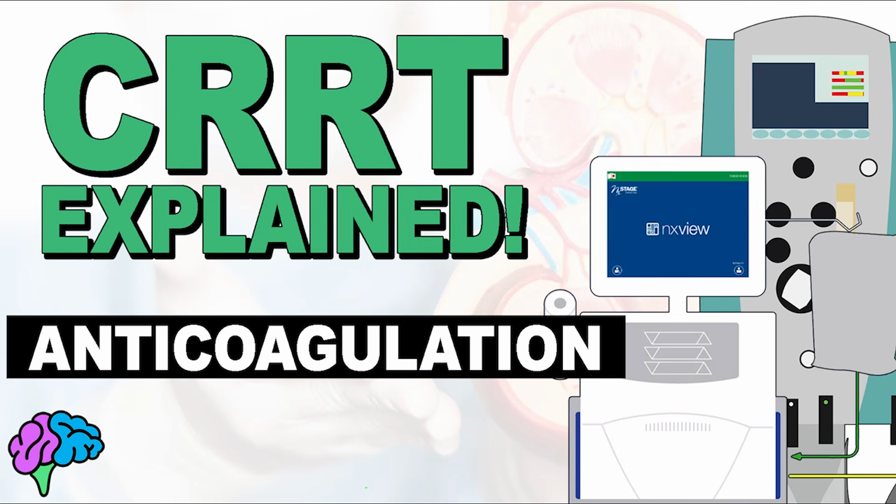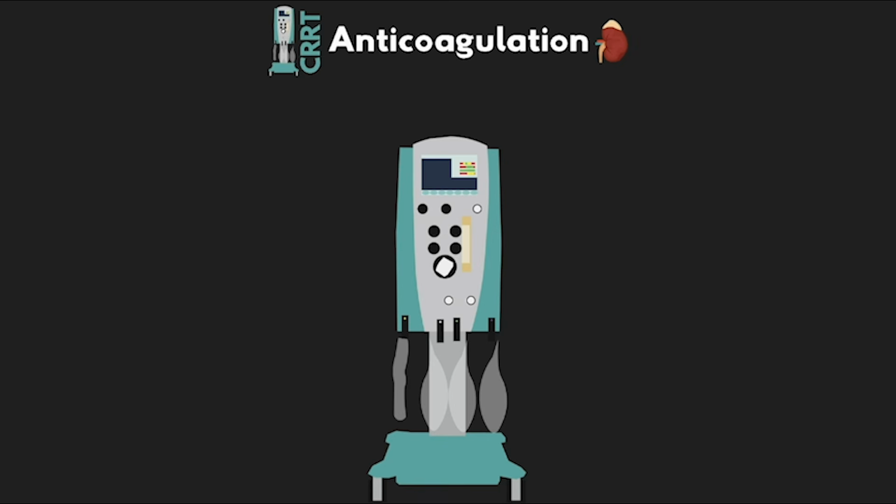This is going to be the 5th lesson in the CRRT Explained series, and in this lesson we're going to be talking about anticoagulation. There are a couple guiding principles as well as a couple main anticoagulants that we might use, and so my goal in this lesson is to try and break them down so that you guys have a good understanding of what we're doing with them. And so let's start off and talk about why it is that we anticoagulate. The whole purpose for using anticoagulation is going to be to maintain longer filter runtimes.